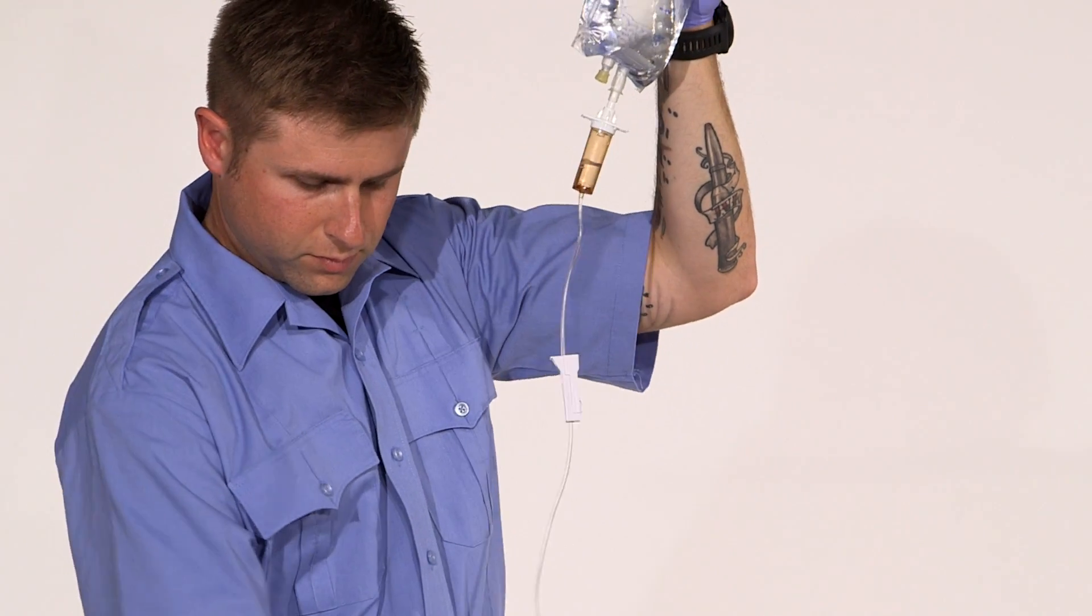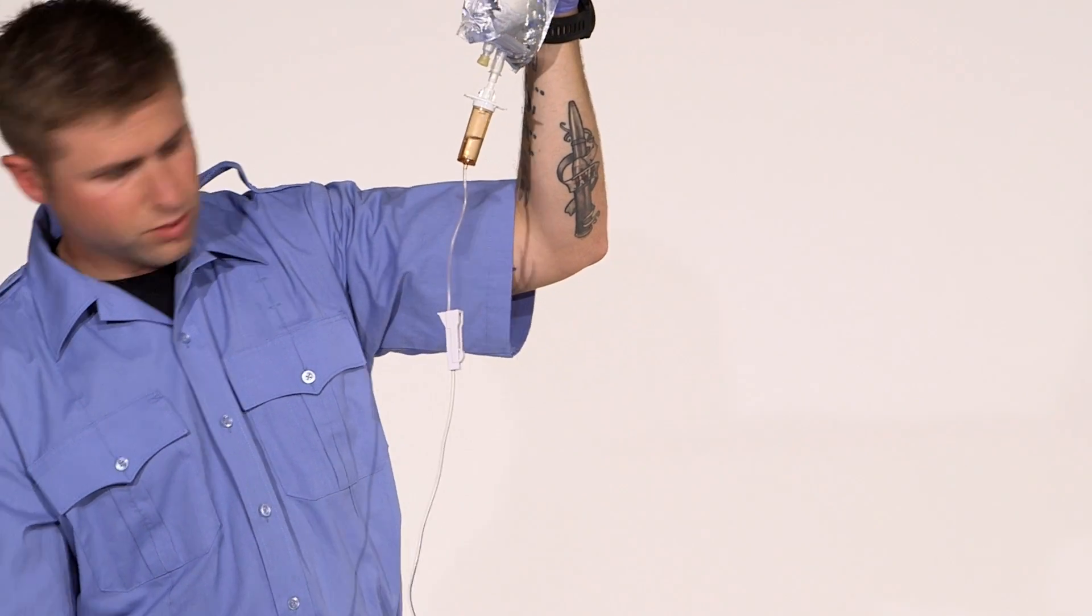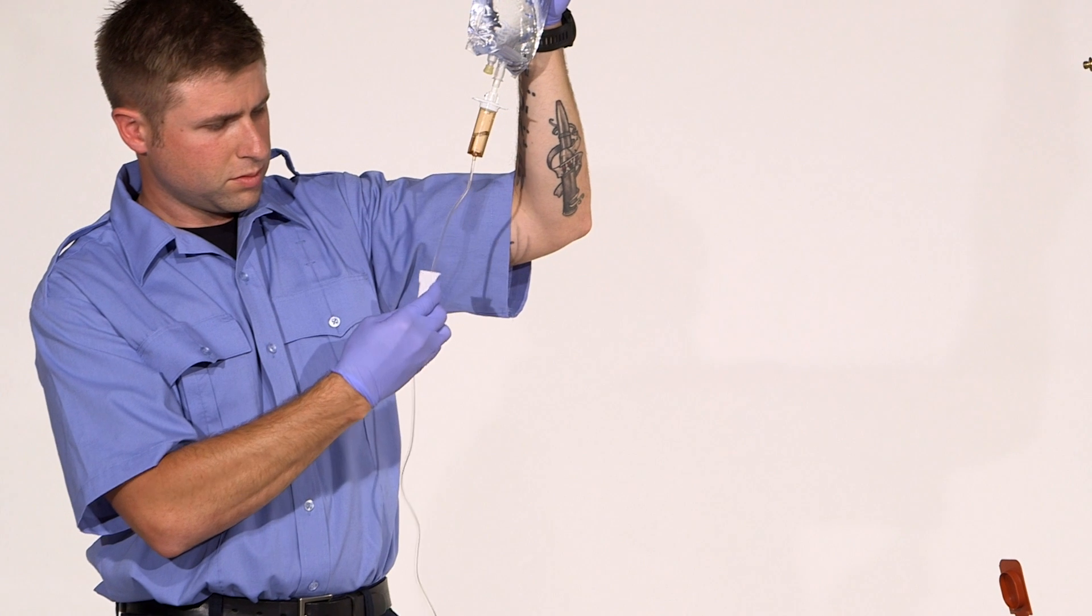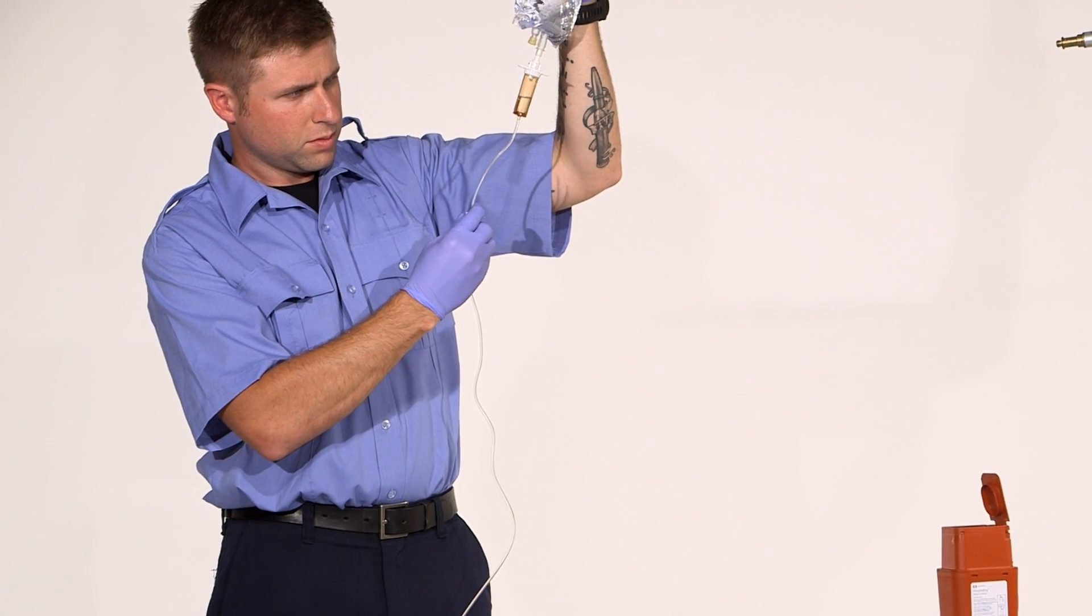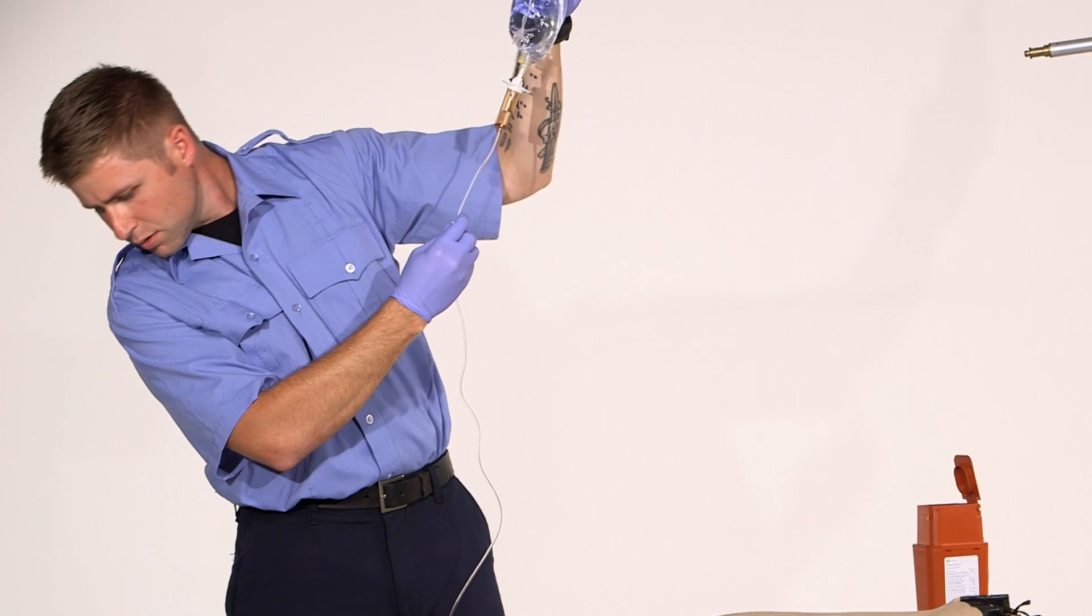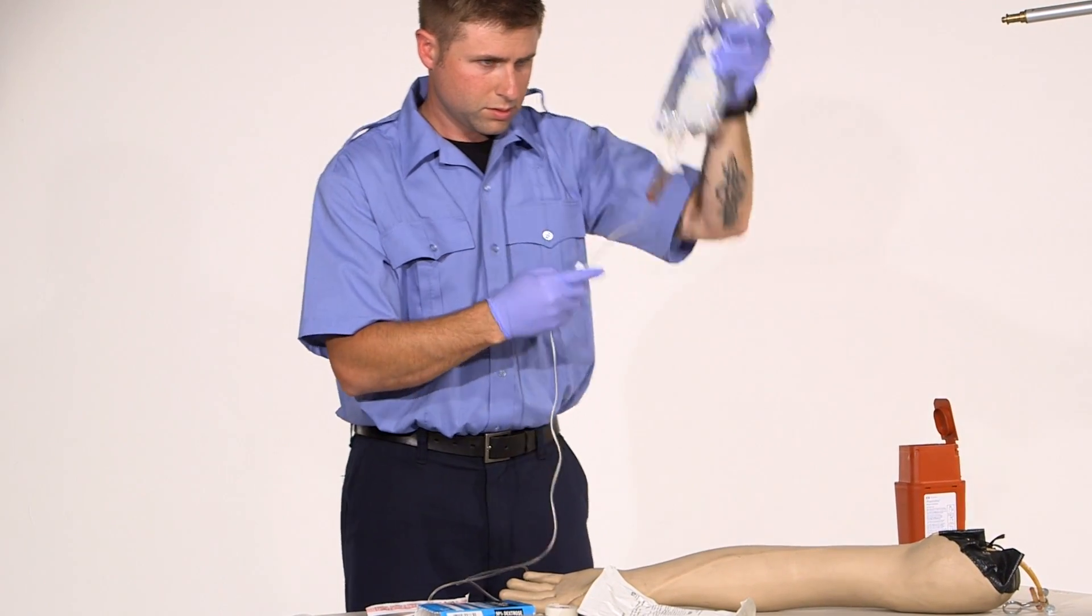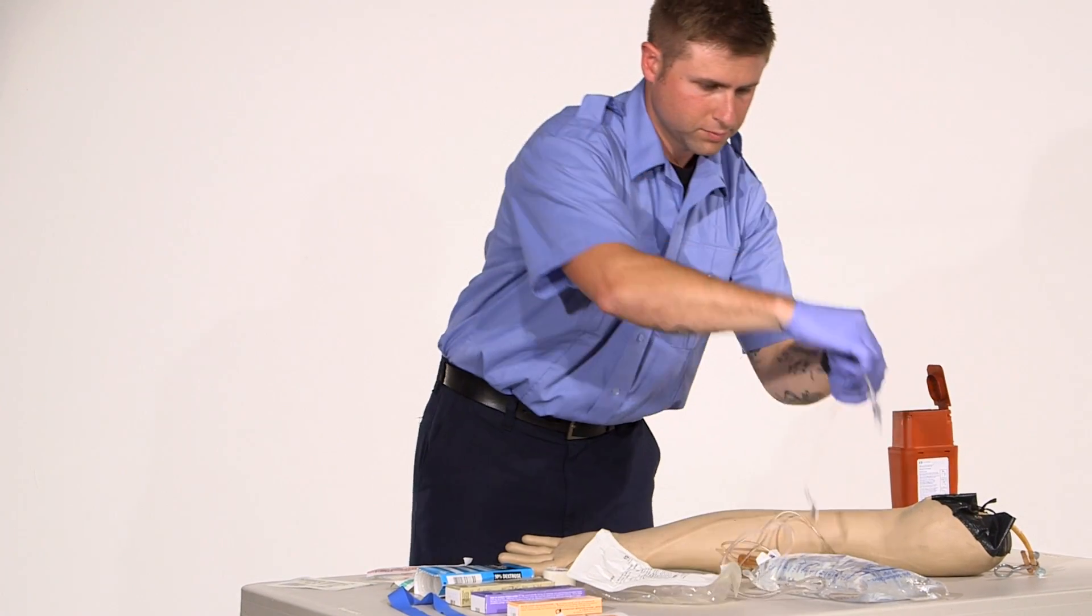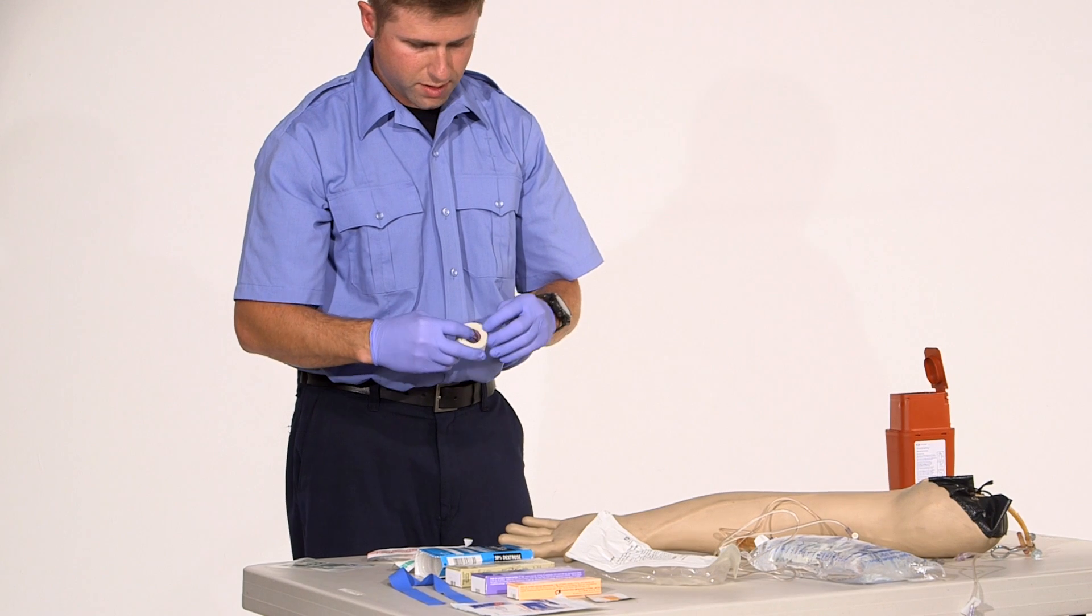I'm going to set my line over, make sure I get all the air out of my line. All the air is out, excellent. At this point, I'm going to cut some tape.